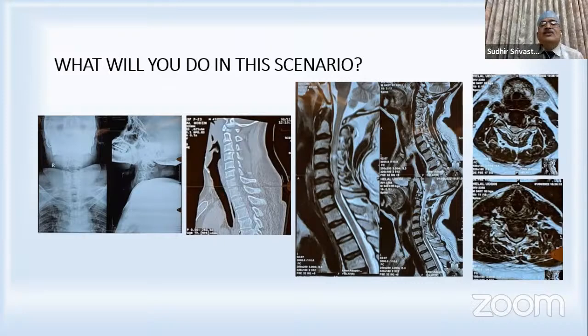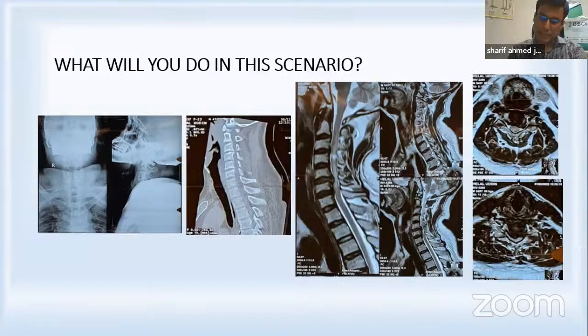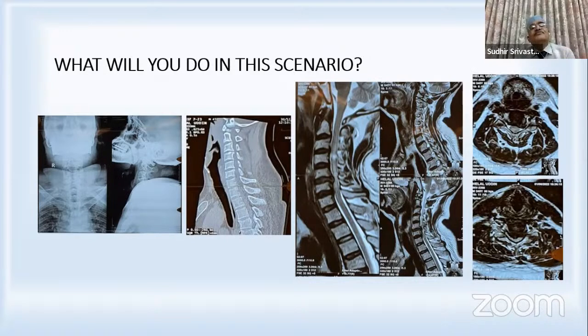Here, as Dr. Manish mentioned, you require contrast and all. Here, you can see the disc coming out and causing compression at this lower level. I would say it is C5-6, because C5-6 is also a mobile area. And as mentioned by Dr. Dhiraj, there are slight degenerative changes in the column, so that might contribute to the amount of trauma. But the patient has shoulder, elbow and wrist flexion grossly diminished. I mean there is no motor movement at all. That is the reason I'm telling you. You can see the signal changes from C3 downward.